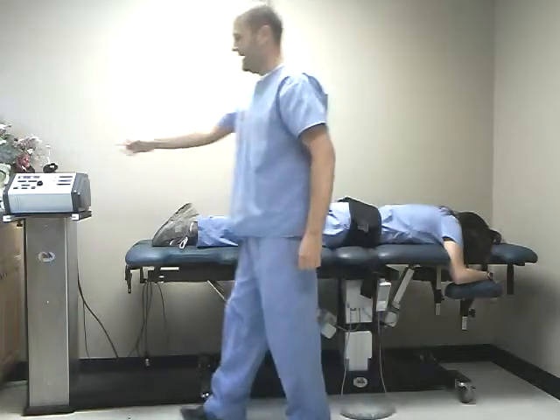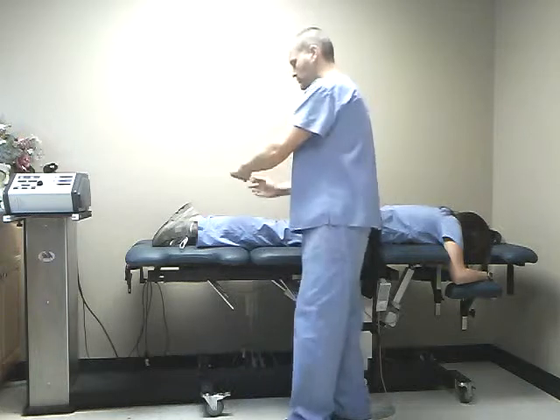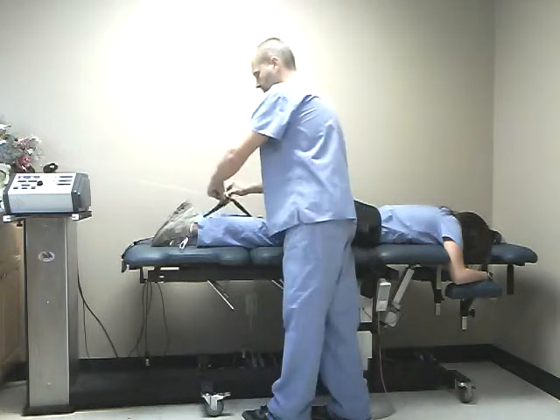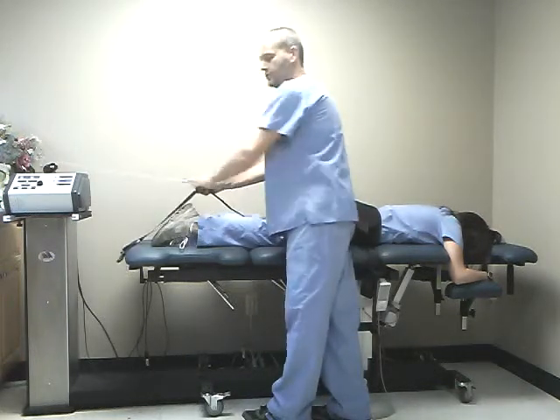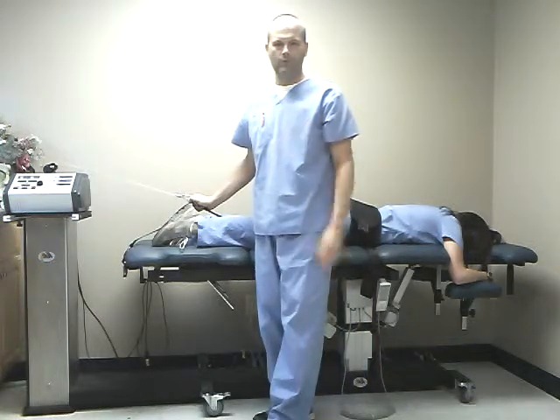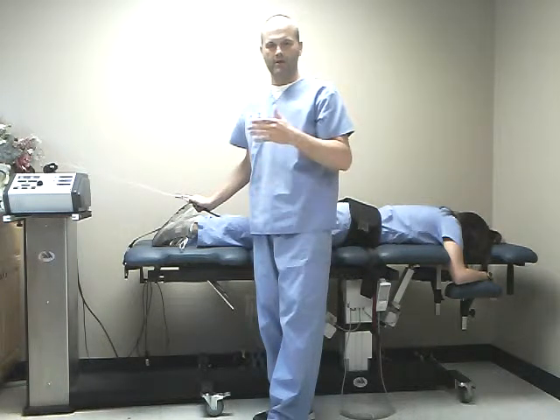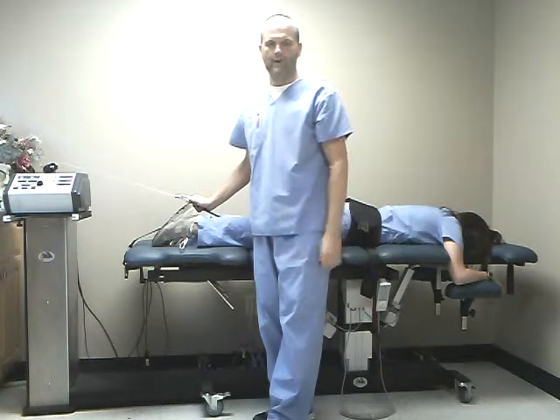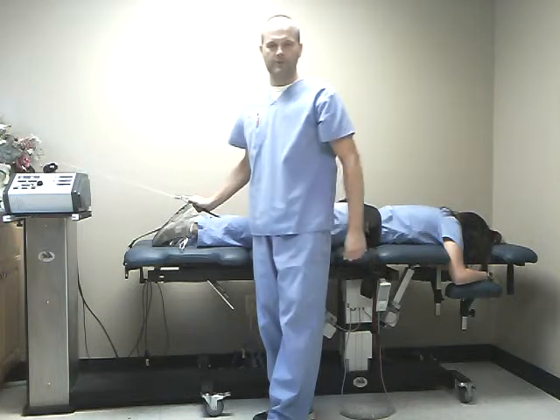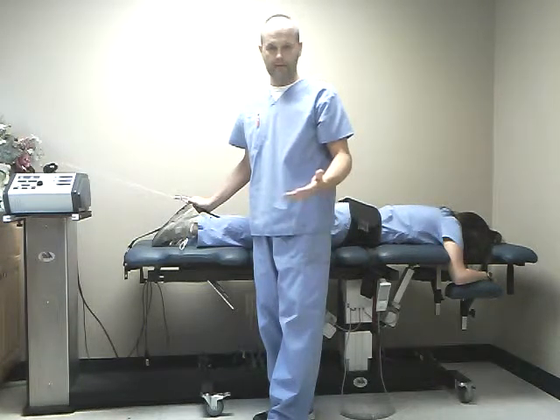and then we attach the traction head with this cable to this belt, and then determining what amount of force or weight that we want the traction head to pull and the time, that is all determined through our evaluation. And basically we just hit the start button, and about 10 minutes later the therapy ends.